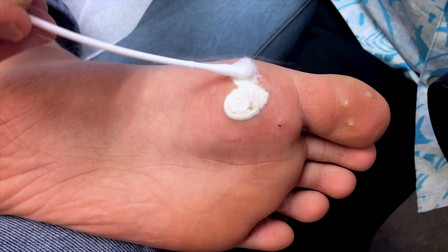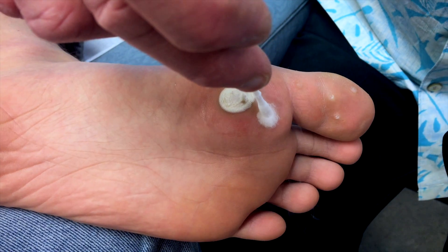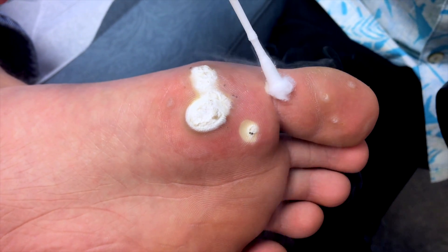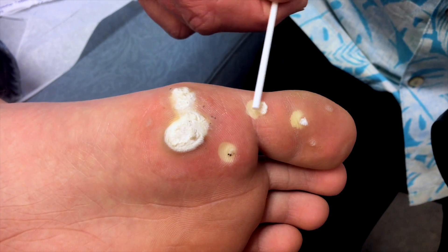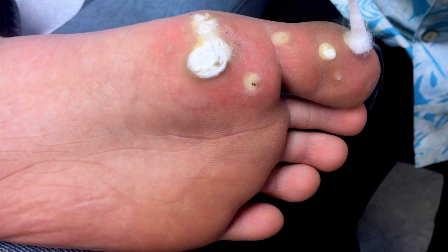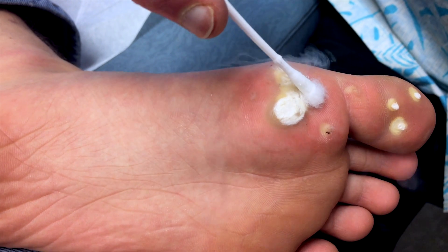It doesn't feel like them though. It's not feeling so good anymore? No. Okay. Take a look at that face. Good one. You're so brave, you're being a really good sport about this. I'm just teasing you, but you're being really brave — I've had this done and it hurts. You've got normal tissue frozen there and there, and that hurts like heck. We don't necessarily have to freeze every last one of them, just to be sure. Because when you get blood flow to the area against a few of them, your immune system starts taking over. I'm about to call it quits. You've endured much — endured much torture.